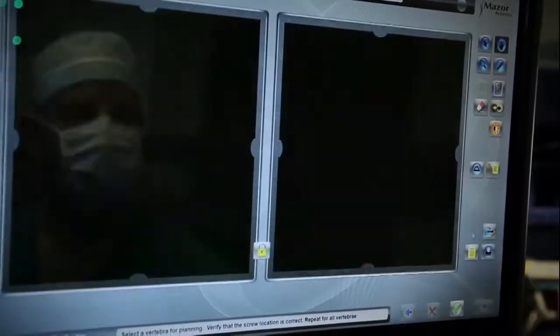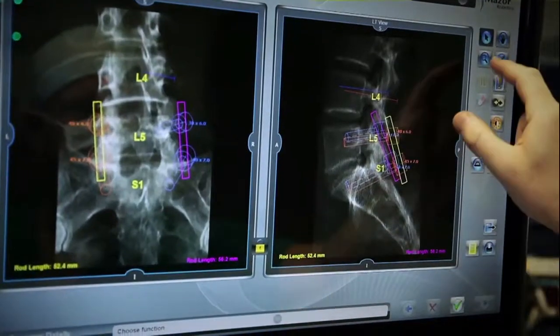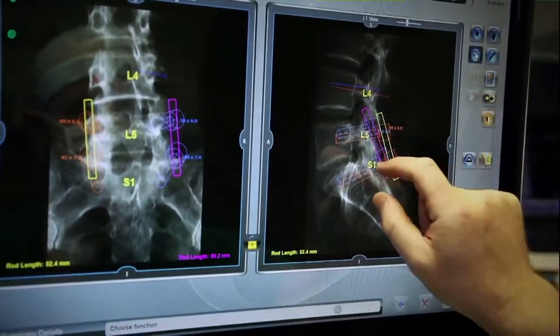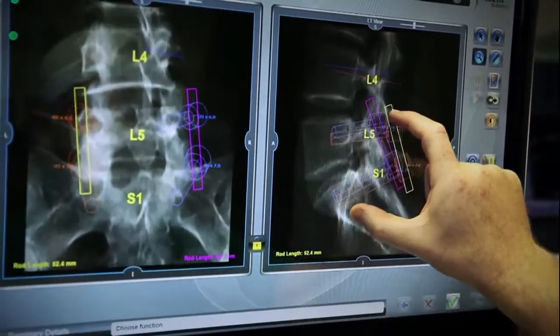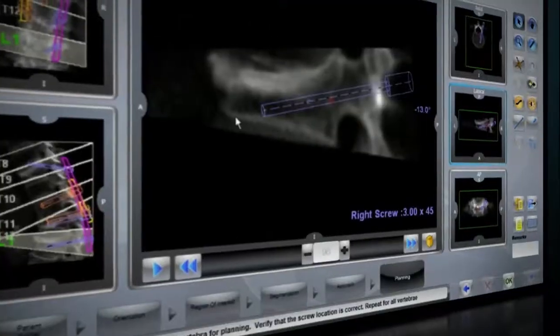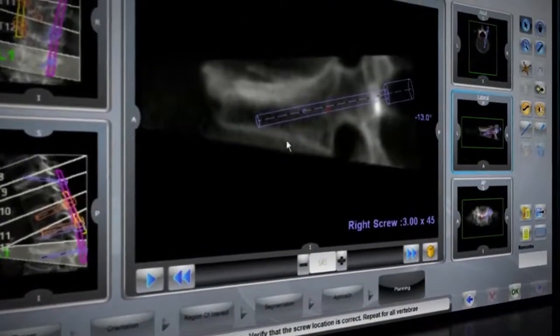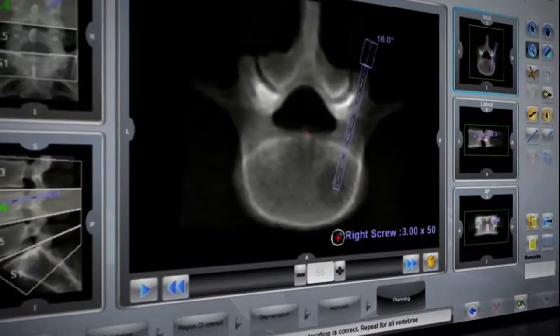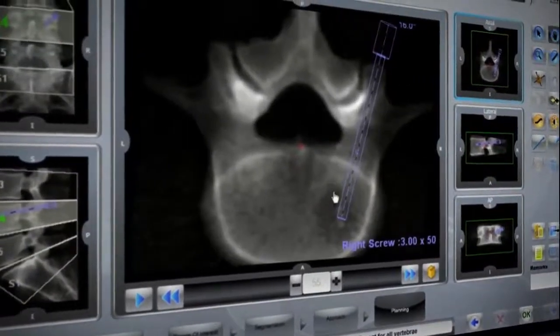The preoperative surgical blueprint can be reviewed in a virtual video mode displaying the anatomy slice-by-slice in all three surgical planes.